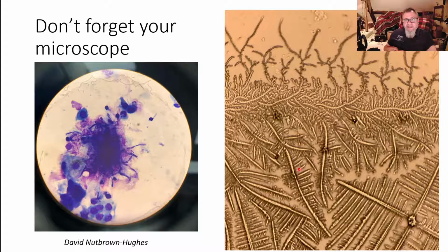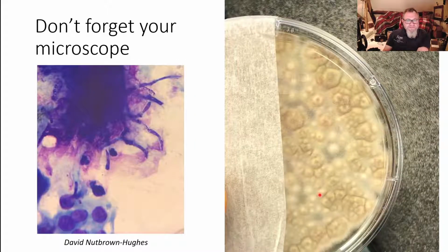As they crystallize, the mucins, the large molecules, will affect the pattern you get depending on their length and their regularity, so whether they are all the same or different lengths. And this beautiful tear ferning pattern is related to tear film quality. So this is David's photograph, and we can see this branching filamentous septate hyphae, which is very typical of aspergillus, which we then subsequently grew.